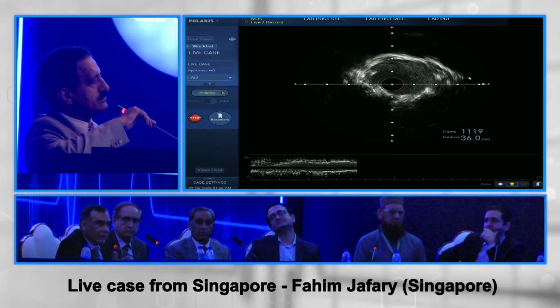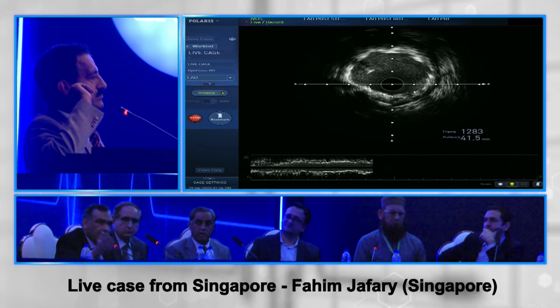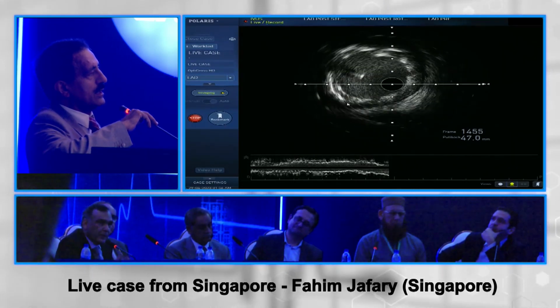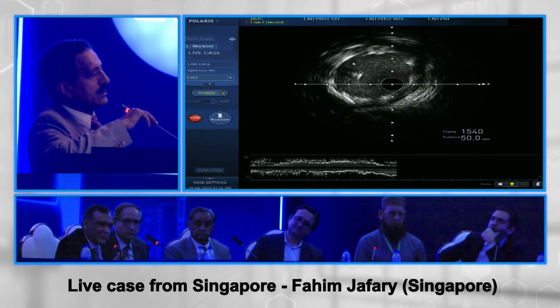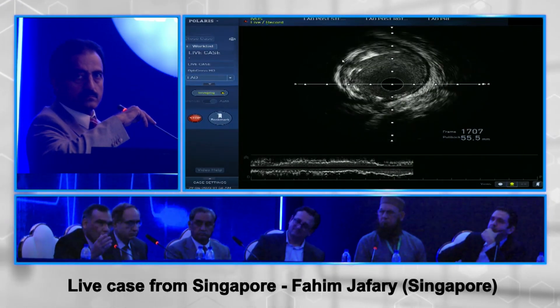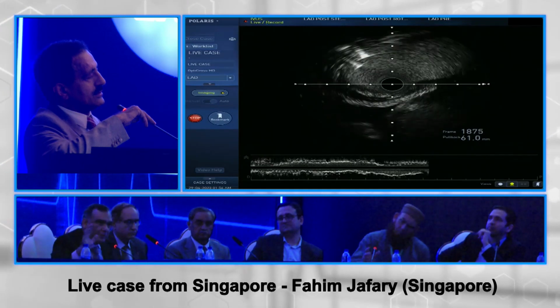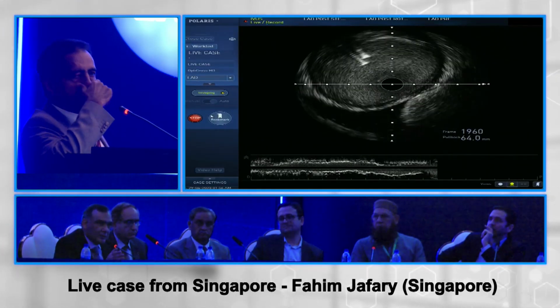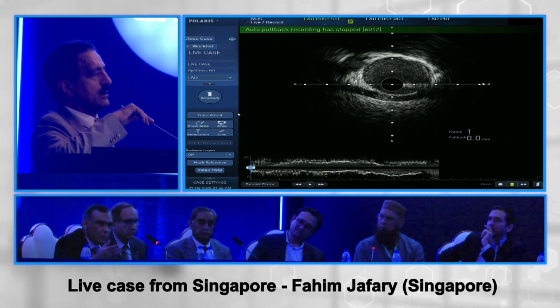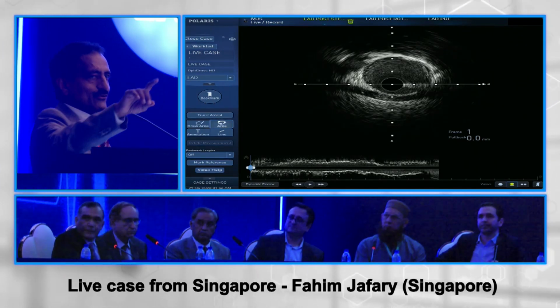For our teaching, it is important that malapposition in all studies has never been clearly defined, like stable angina. But common sense, mechanistically, if there is enough space outside the stent where there is stagnant flow, you're going to get some thrombus which might propagate inside. Although studies have shown malapposition is not as bad as under-expansion, if you have an under-expanded stent with an area less than 4 mm², you are going to get a problem with restenosis. I'm sorry, we have to stop, Hamza.